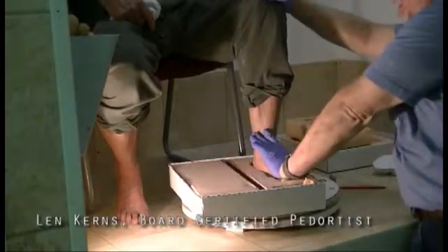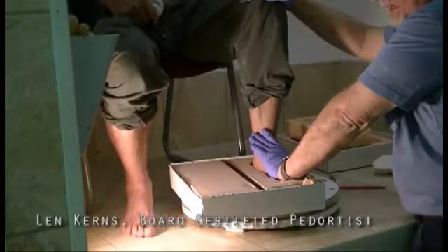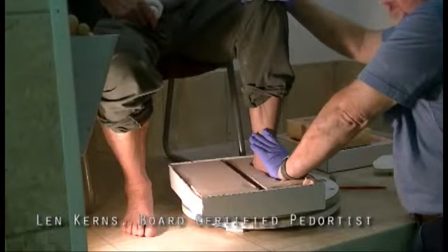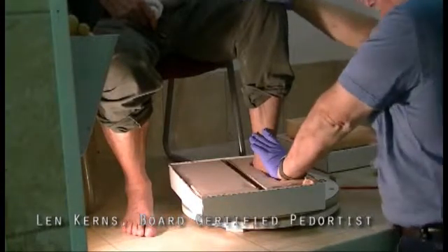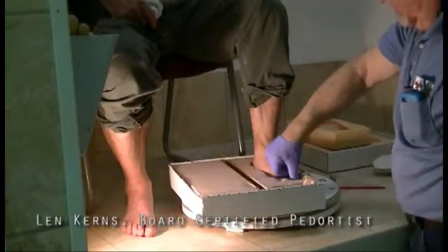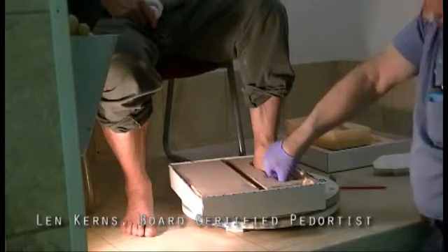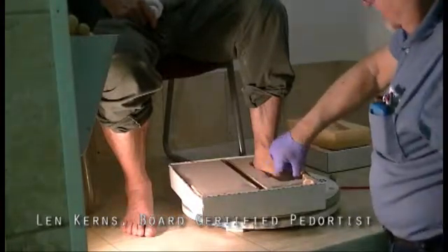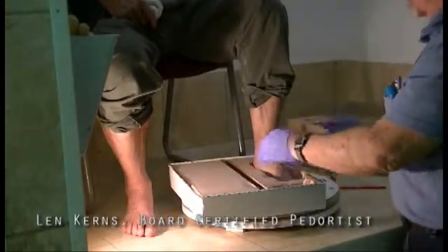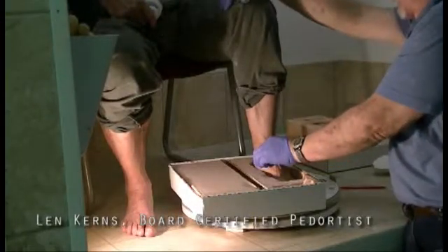And you don't roll your hand over and push the first metatarsal and second metatarsal down, because then you would be taking away the deformity that the lab wants to see. In 80% of the casts that we get in, there's a forefoot varus of approximately 3-4 degrees. Now I'm pushing the toes down. And as in the instructions on the internet, of course, you're supposed to center this in the box. I'm just letting it slide for the movie right now so you can see it better.